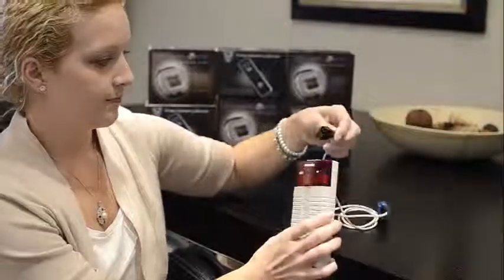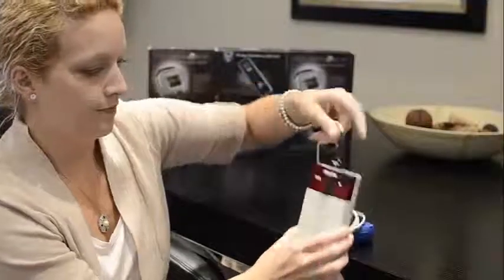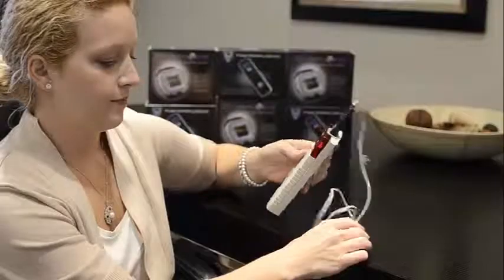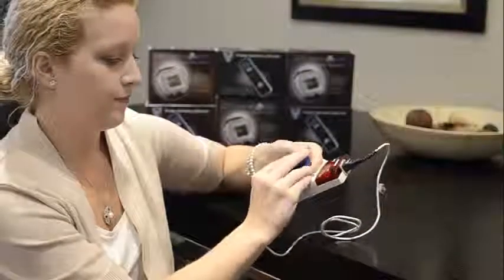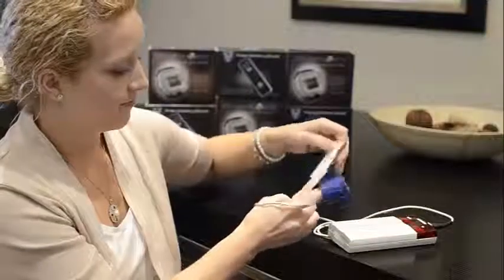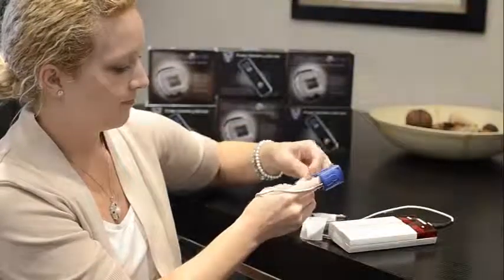Step 2: ensure that the sensor is attached to the top of the pulse oximetry device as shown. Step 3: attach the sensor to your index finger. Apply tape or a band-aid to secure the sensor to your finger.